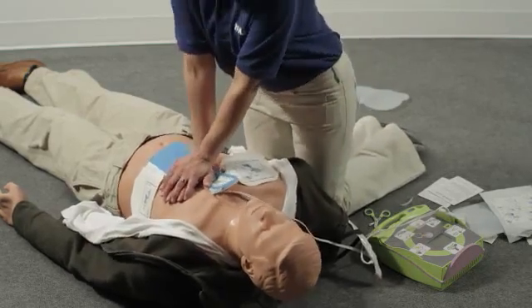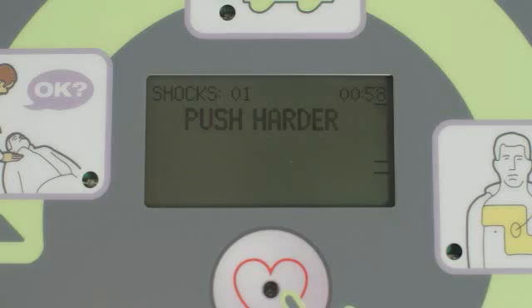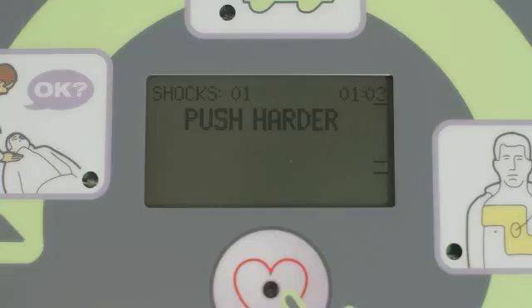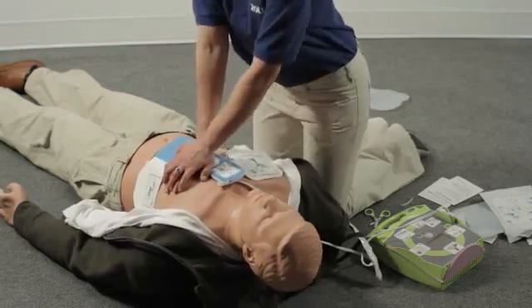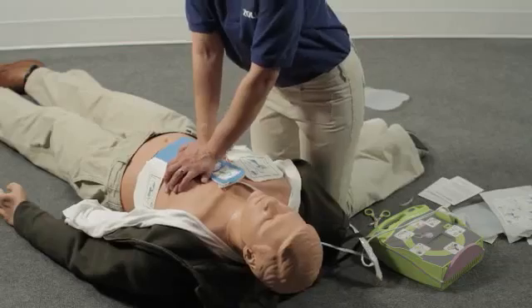If your compressions aren't at least 2 inches deep, the AED Plus will let you know. The AED will let you know every 15 seconds if you don't reach the target CPR depth. Push harder. After being told to push harder, if your compressions reach at least 2 inches, again, the AED Plus will let you know. Good compression.